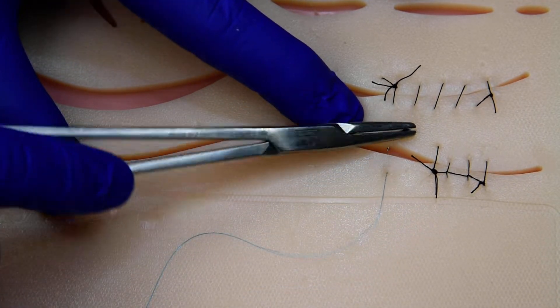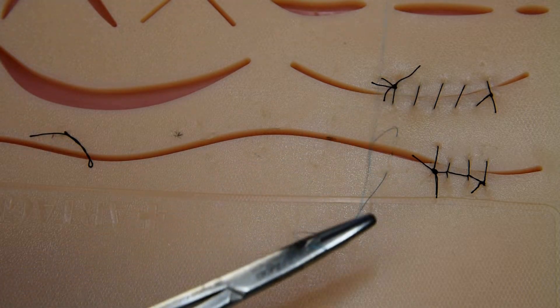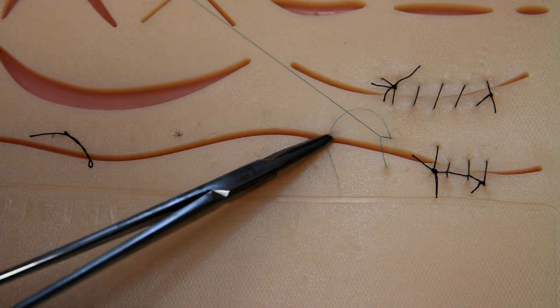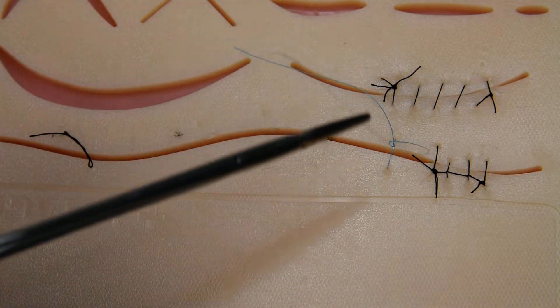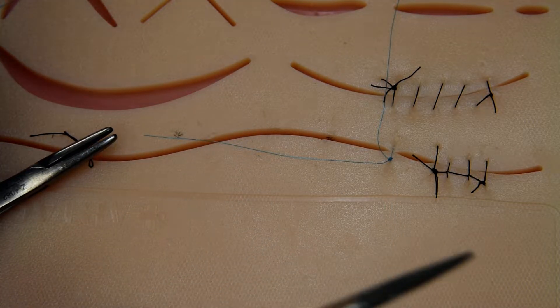We'll throw our first simple interrupted, just like the other two techniques. Get that to lay nice. See how the nylon monofilament allows you to cinch a little bit easier? It's more slippery, so it doesn't lock itself out.